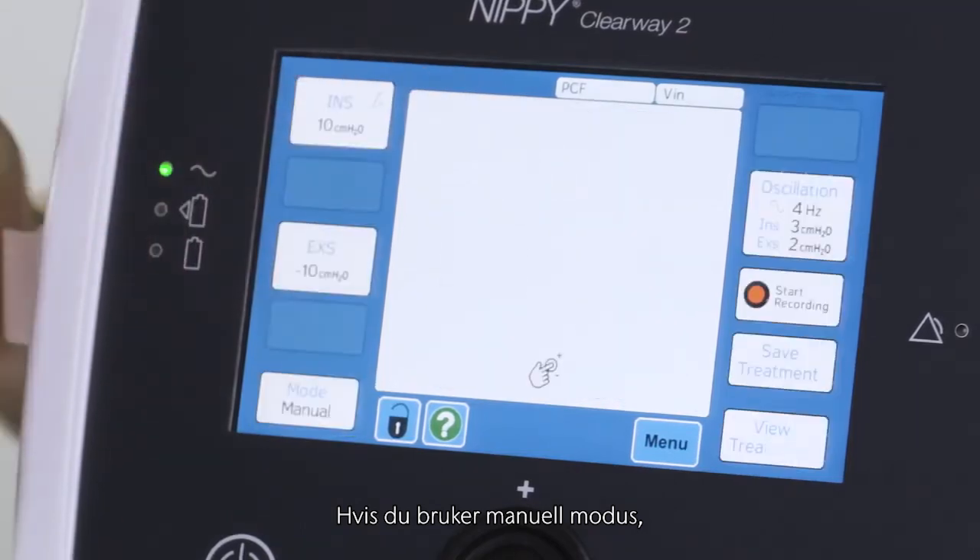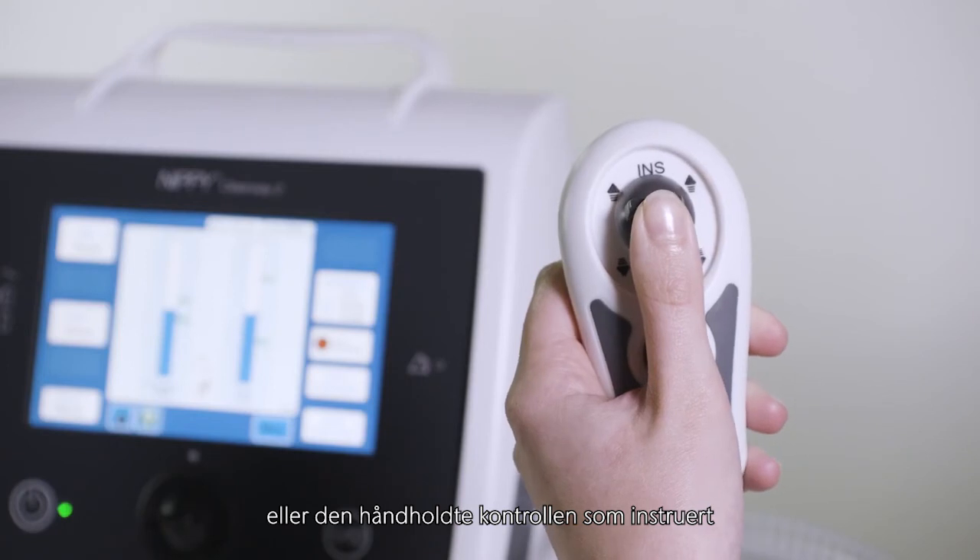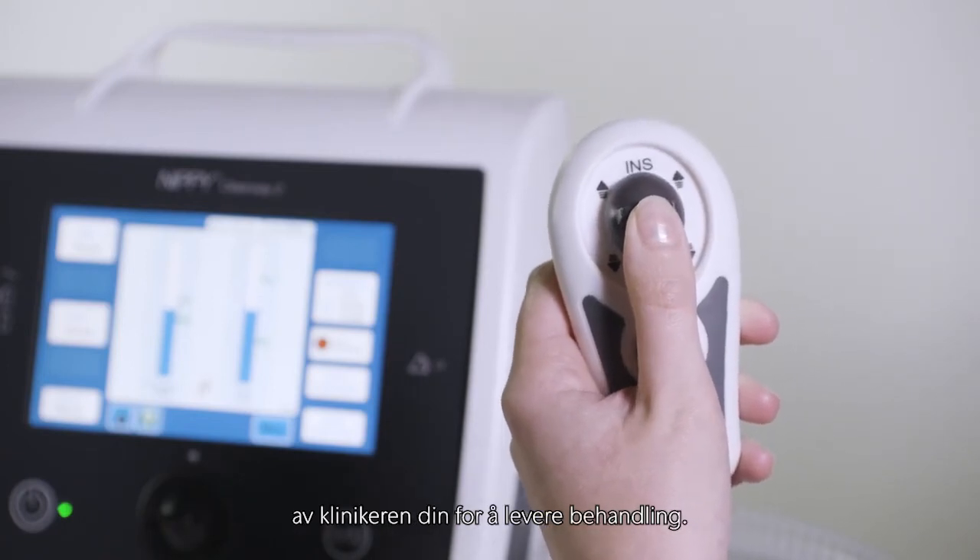If you are using the manual mode, use the switch on the front panel of the Clearway 2 or the handheld control as instructed by your clinician to deliver treatment.